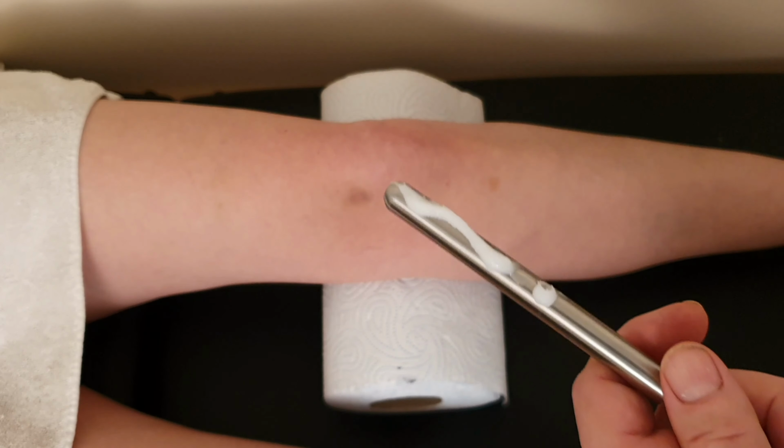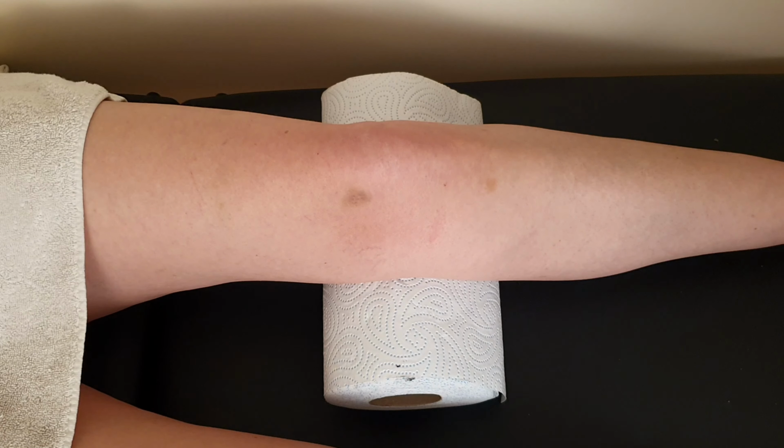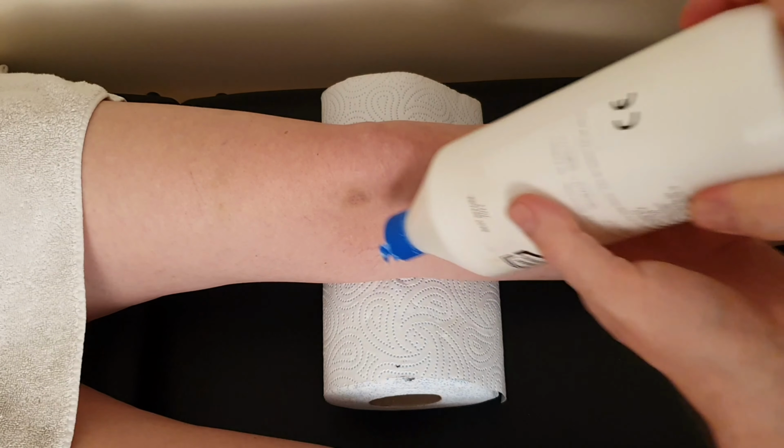A little bit of contact medium onto the earthing electrode. I'll spread that out and then put it under a fleshy part of the patient. If you've seen any of my other videos, you'll know I don't like putting it under bony parts, so I've chosen to put it under the other leg. Would be under the Achilles tendon if I wanted to earth the left leg properly here. So I'll just use the other leg instead, it really doesn't matter.